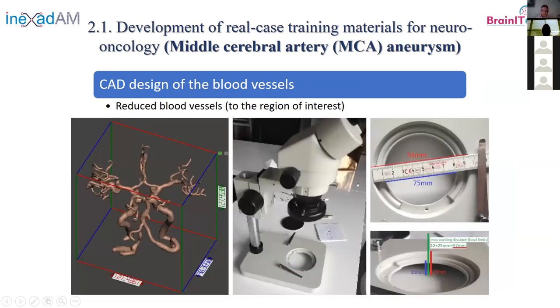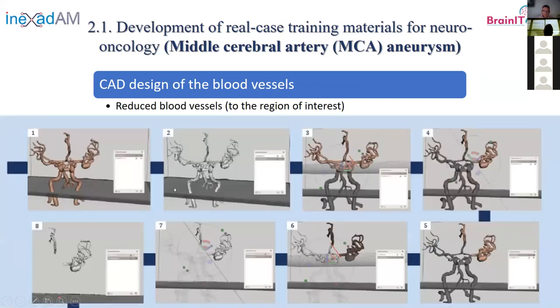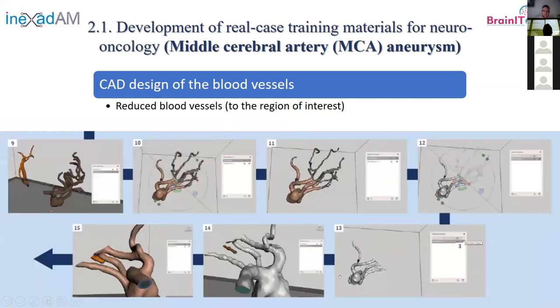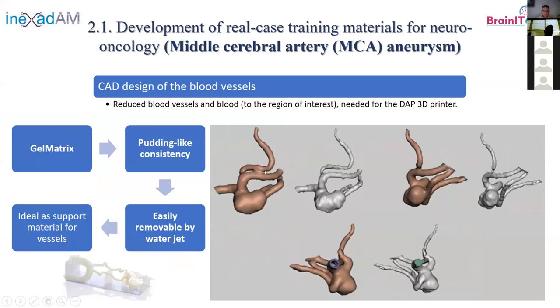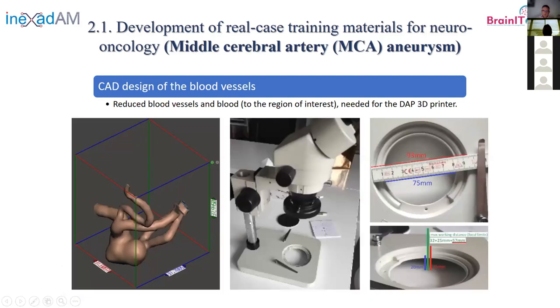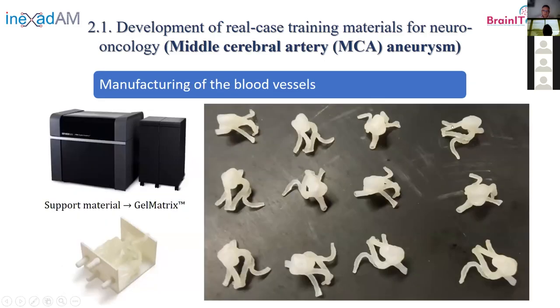We did all the features in the software. Since the students were going to work under the microscope, the full vessel size was too large, so we focused on the region of interest and did cut features to obtain the final models. To 3D print this, we had to provide the tubes and the blood inside the tubes because the Digital Anatomy printer uses a very innovative gel matrix support material — like a gel with pudding-like consistency, easily removable with water. We produced this with the specified dimensions and here you can see all the replicas printed with the Digital Anatomy printer.